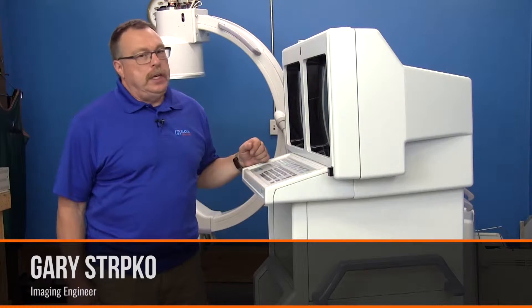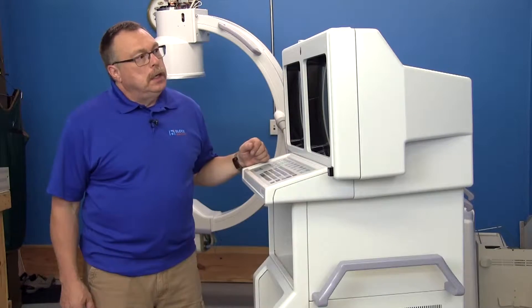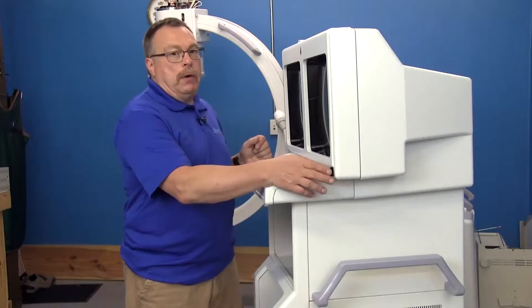Today we're working on an OEC 9800 and we are going to replace the on and off power switch.